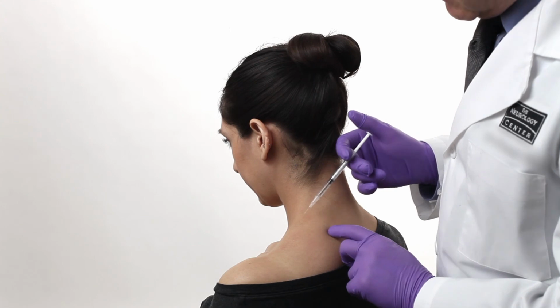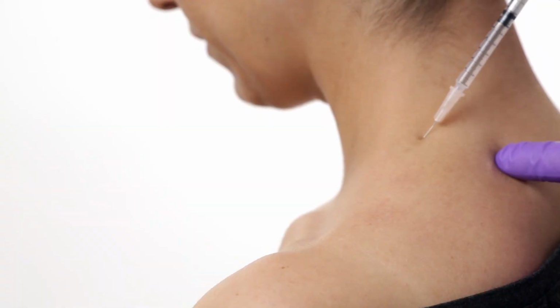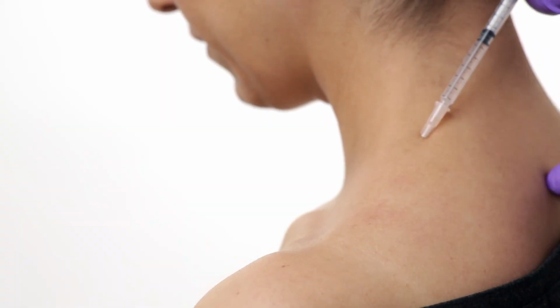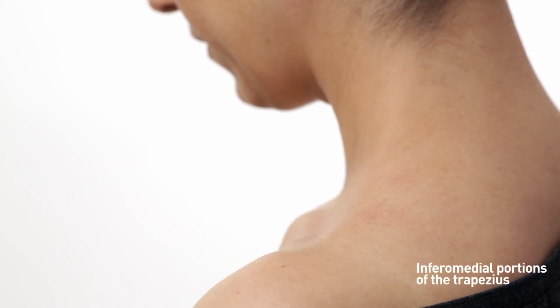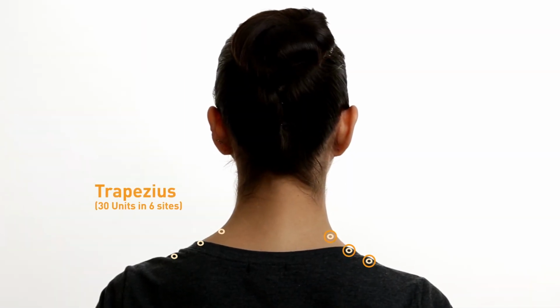For the third injection, move about 3 centimeters, or approximately 2 fingers breadth, medially up along the trapezius from the midpoint. Stabilize the hub of the needle and make the injection. The inferomedial portions of the trapezius should be avoided to limit the possibility of neck weakness. Repeat the procedure symmetrically for the contralateral side.